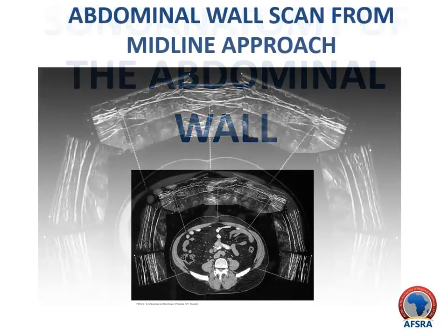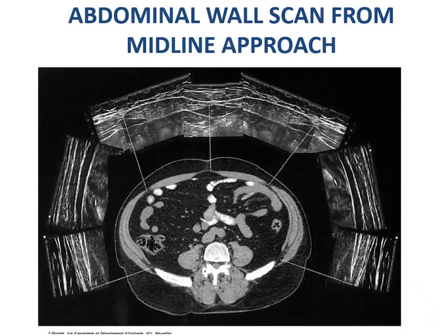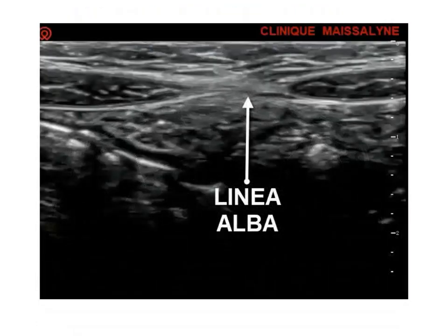Scan the abdomen from the midline. This allows identification of the linea alba and the rectus abdominis muscle. The rectus abdominis muscles lie on either side of the midline of the abdominal wall. They are encased within fascial envelopes — the rectus sheath — formed by the tendinous portions of the abdominal muscles. The two abdominal muscles are separated in the midline by the fusion of the aponeuroses of the abdominal muscles: the linea alba. The linea alba can be readily identified with ultrasound.